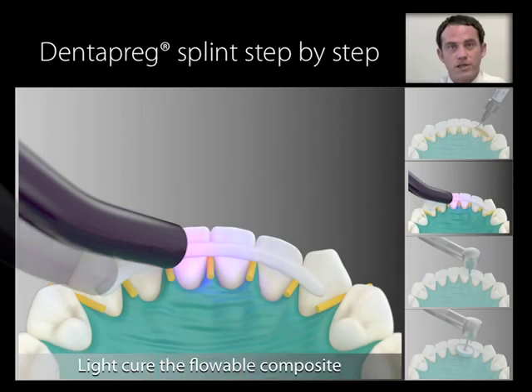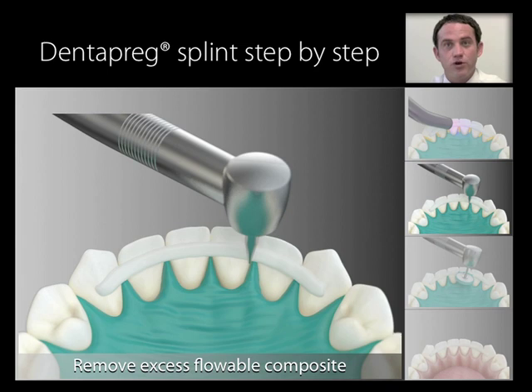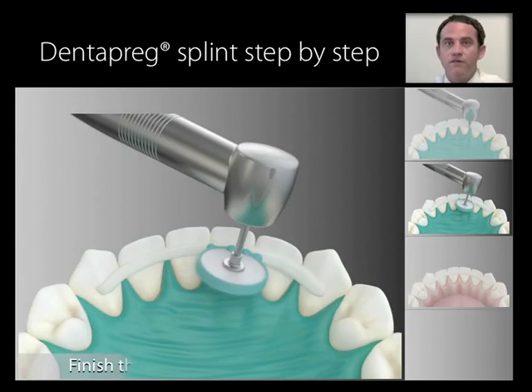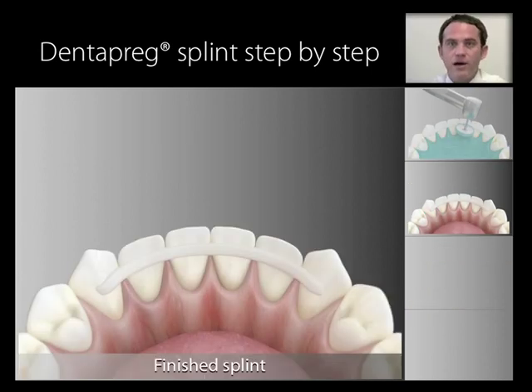Light cure the flowable composite according to the manufacturer's instructions. Remove any excess flowable composite as you normally would. Finish the splint surface by polishing. Now you have a splint that's aesthetic by being hardly noticeable. You've created a structure that is minimally invasive and you didn't need any special tools or special products that you wouldn't normally have in your office.